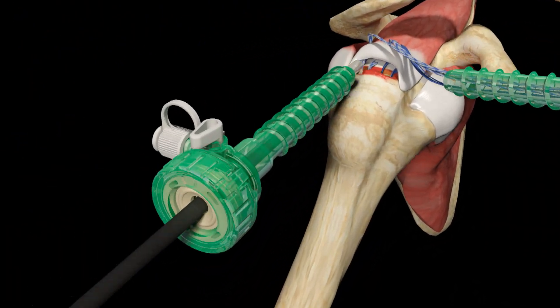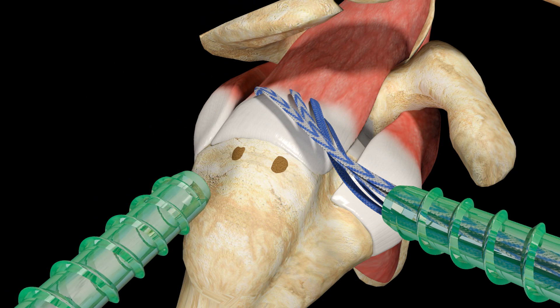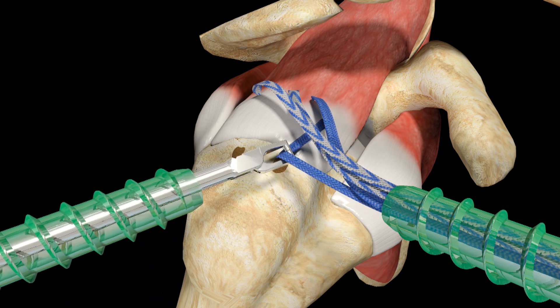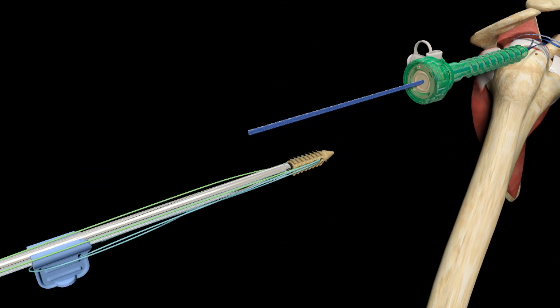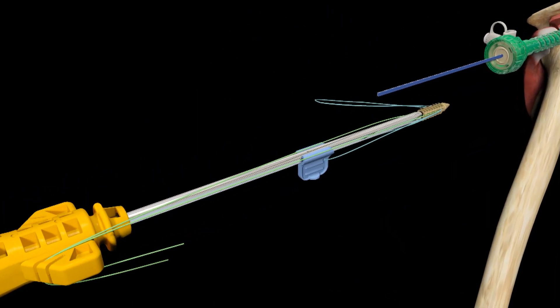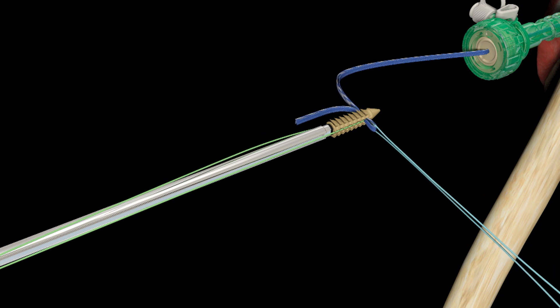Using the DePuy Mitek radiofrequency probe down the lateral cannula, mark on the lateral aspect of the greater tuberosity the two points where the lateral Footprint Ultra PK suture anchors are to be placed. Using the suture loop grasper down the lateral cannula, retrieve the most anterior limb of Ultra Tape from each of the medially placed anchors and bring these two limbs back out of the lateral cannula. Thread both limbs of Ultra Tape through the inserter threader tab and pull through the eyelet of a Footprint Ultra PK suture anchor.